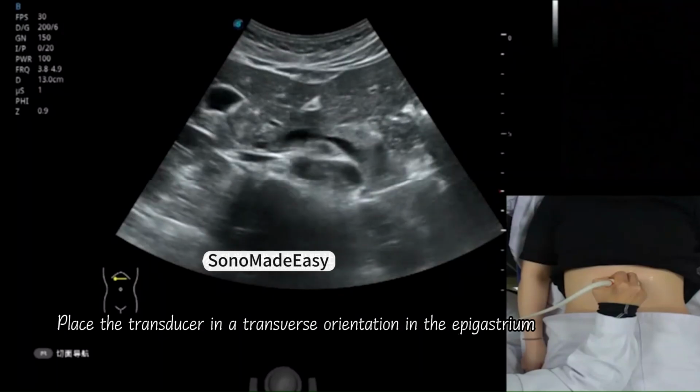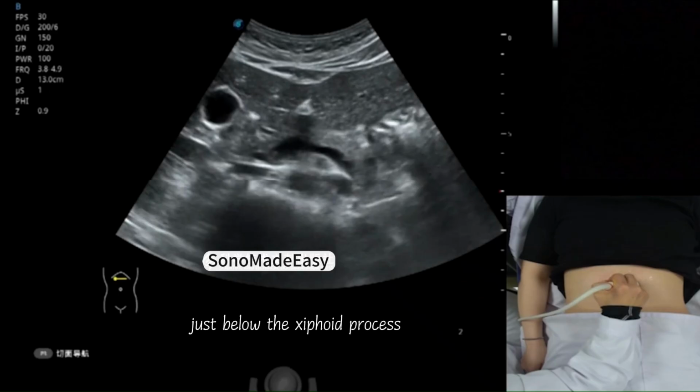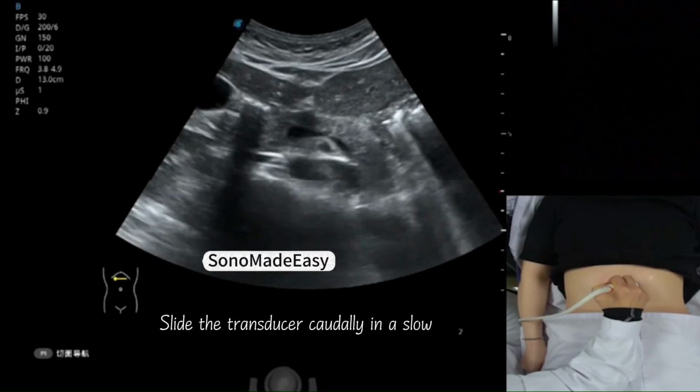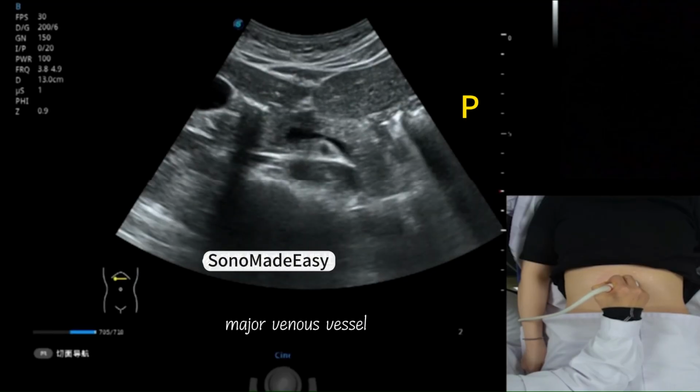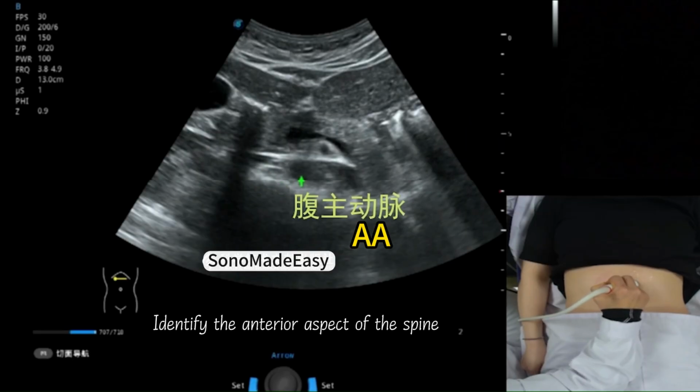Place the transducer in a transverse orientation in the epigastrium, just below the xiphoid process. To visualize the left lobe of the liver, slide the transducer caudally in a slow, steady motion to identify the horizontally oriented major venous vessel, which serves as a landmark for the pancreas. Identify the anterior aspect of the spine.